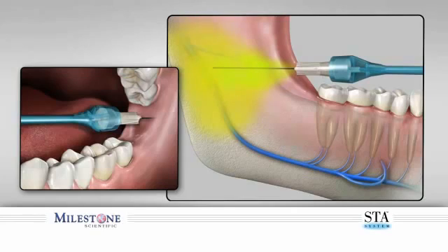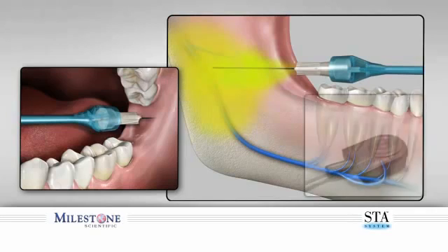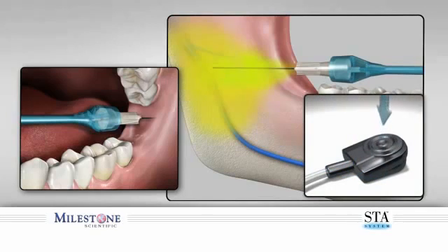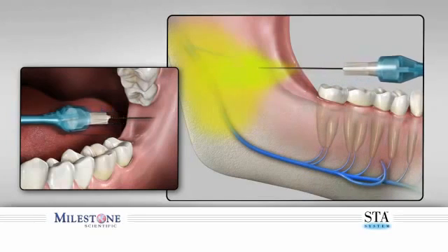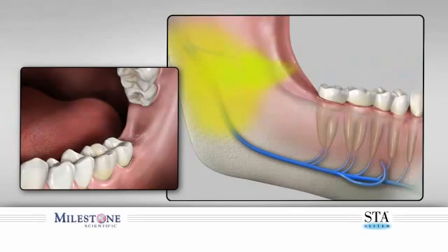When you have delivered the required dosage, you can remove the needle. To avoid anesthetic solution spray back into the patient's mouth, perform the following. While the needle is still embedded in the patient's tissues, depress and release the foot control pedal. Count 3 beeps after releasing the foot control, then totally remove the needle from within the patient's mouth. Direct the needle away from the patient as a small amount of anesthetic solution may still be present.